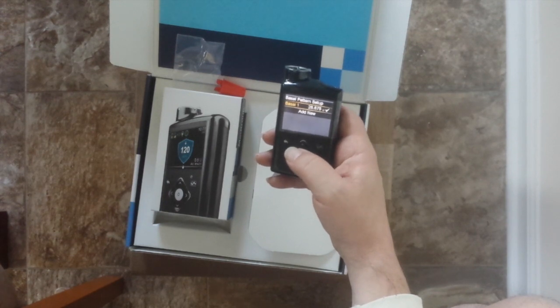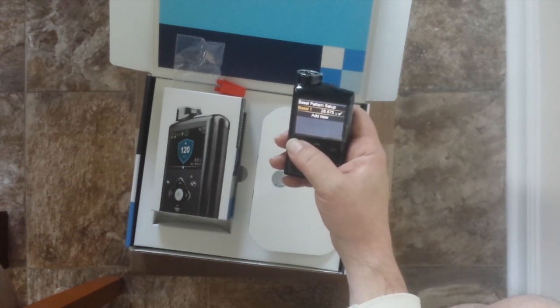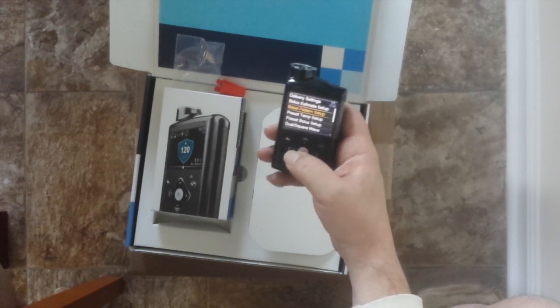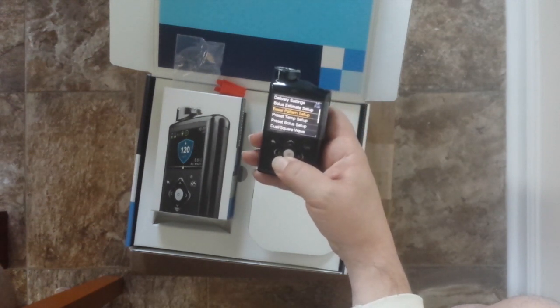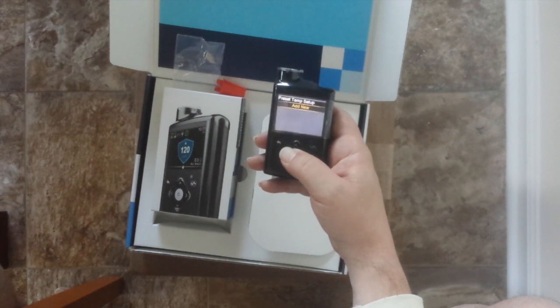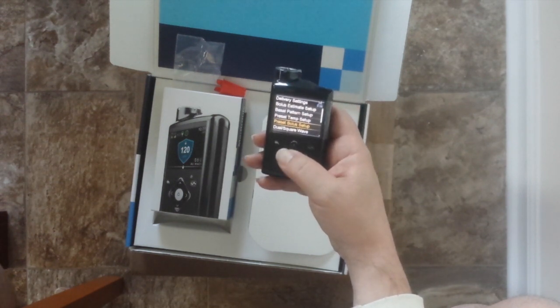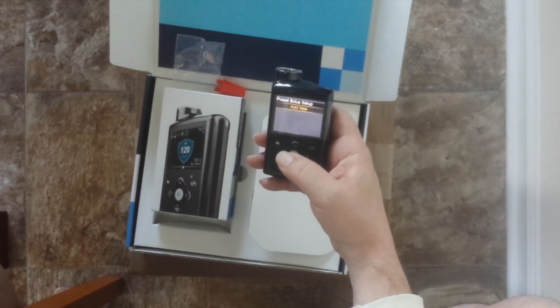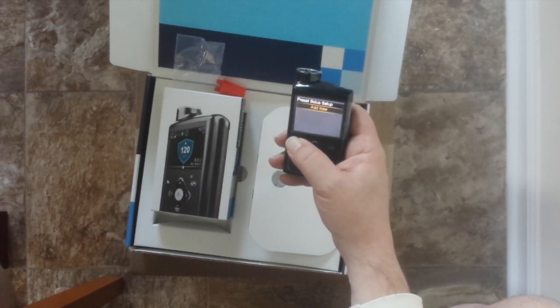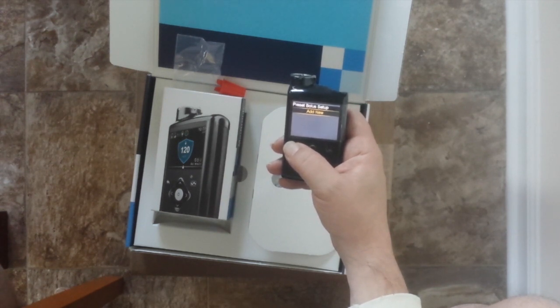Those are my basal patterns. I only have one basal pattern set up — you can set up to three, I believe. Next is preset temp setup, which I'm not sure about. Then there's preset bolus setup — I'll have to read what that is.